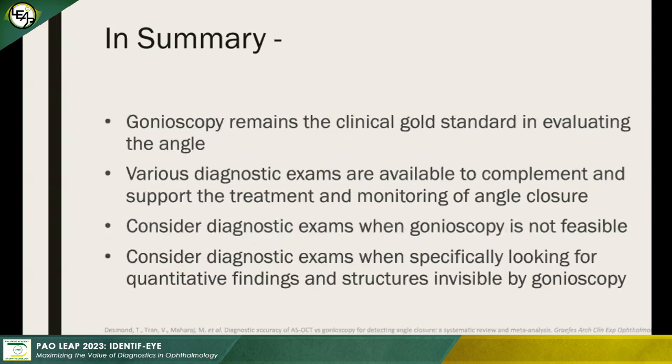Gonioscopy remains the clinical gold standard in evaluating the angle, and various diagnostic exams are available to complement and support the treatment and monitoring of angle closure. And we should consider these diagnostic exams when gonioscopy is not feasible or if you need an adjunct. Consider these when you're specifically looking for quantitative findings or structures invisible by gonioscopy.